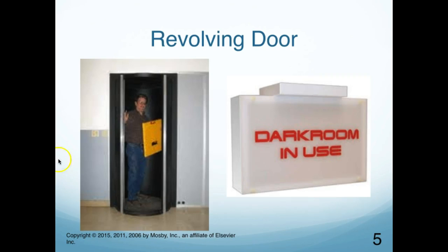And here's this revolving door that I'm used to myself. Typically what would happen is a person would go in there, and there are overhead lights, and then there is the red light, and so as soon as the overhead lights, the white light, get turned off, this darkroom light would turn on, usually above the door itself.